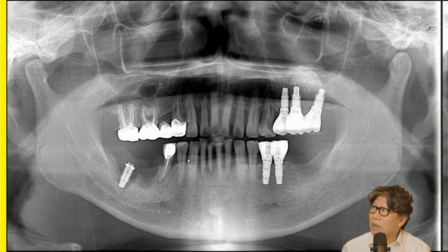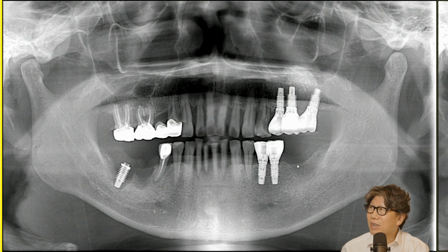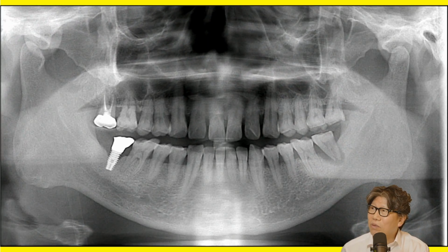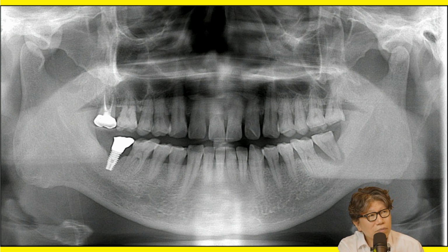It's like this. It's coming. It's broken. It's gone. And this one's still here. And this one's all broken. And then the rest of his teeth were rotting away. And then he came in with a screw that came loose, which I think is a 3-eye implant. He's from out of town. And I don't even remember how many times he tightened it. I don't know if he finally gave up on me or not.